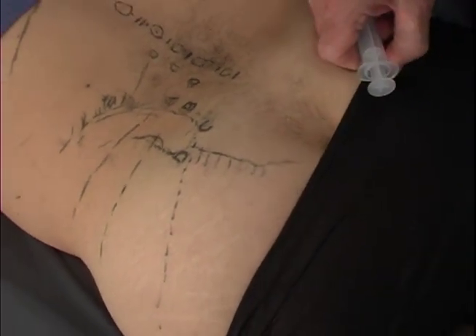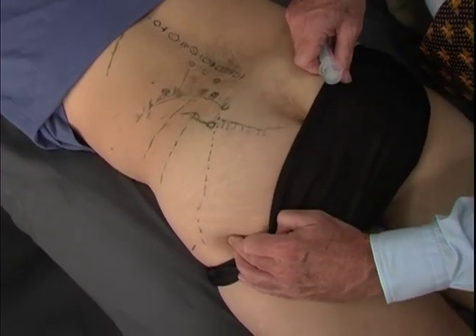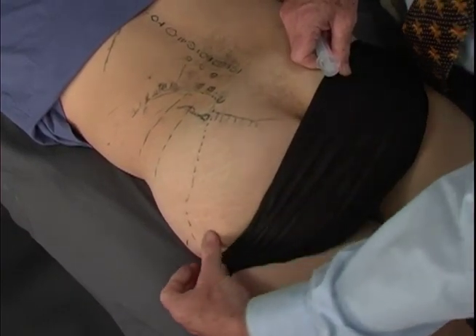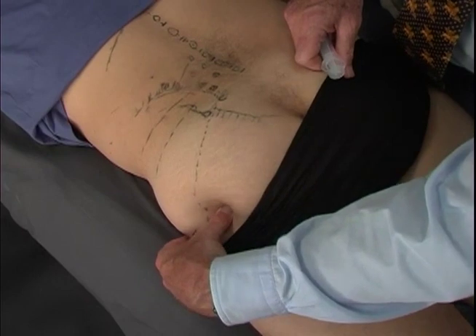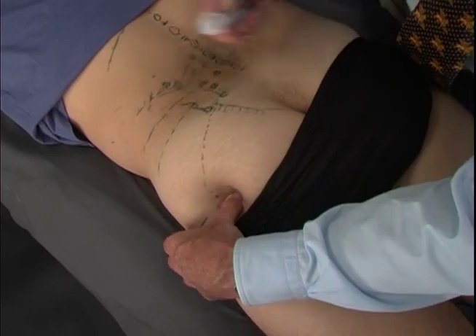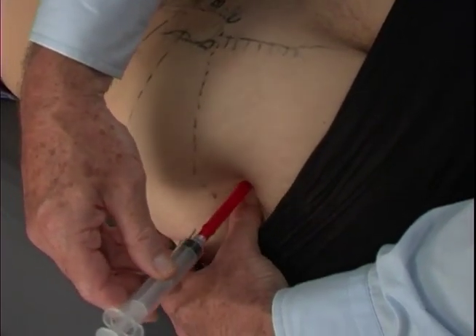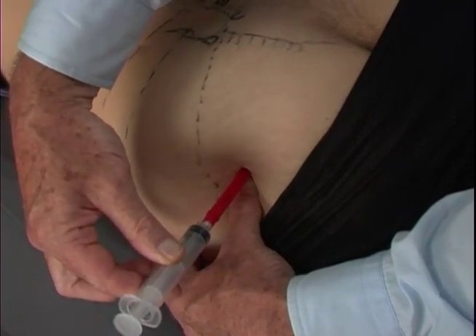It's also possible here to do the posterior part of the trochanter. We'll be talking about the trochanter and hip injections in a bit, and to hit the posterior capsule of the hip. Frequently this is a tender area. If you find the trochanter and near the top of it, come down just a hair and then push in very firmly, people will often have tenderness, and this is the posterior capsule area of the hip. So we can come right into this area and hit the posterior capsule of the hip itself, usually a 3-inch needle is utilized in this area.